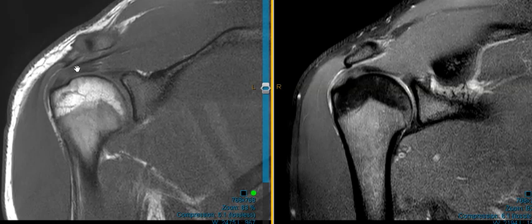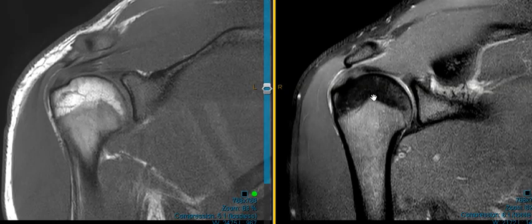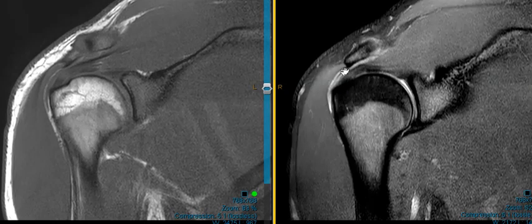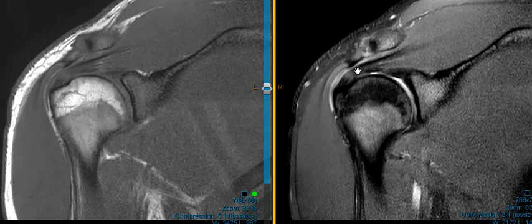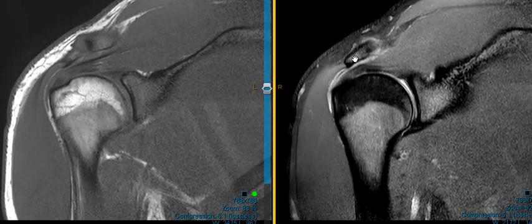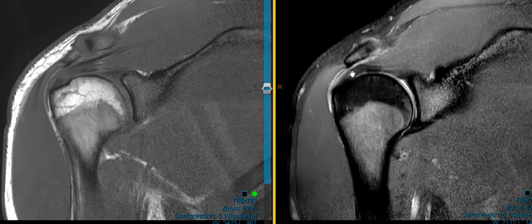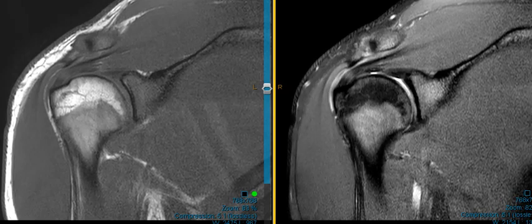It's not a full-thickness tear that needs surgery. The patient also has a little bit of brightness over the surface — this is fluid and edema. We call it peritendinous edema: irritation and bursitis related to this overuse phenomenon. This is the acromion process and this is the deltoid muscle, and this little pocket of fluid here we call the subacromial subdeltoid bursa — so a little bit of bursitis associated with the rotator cuff tendinitis. This is again a very common finding in young athletic people.